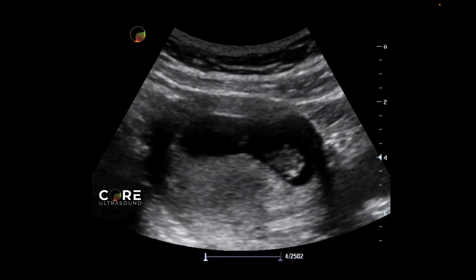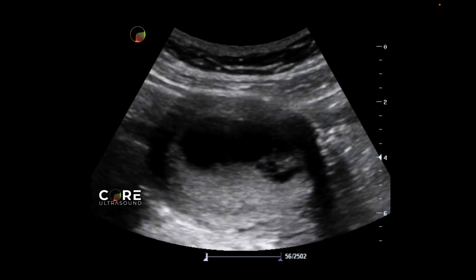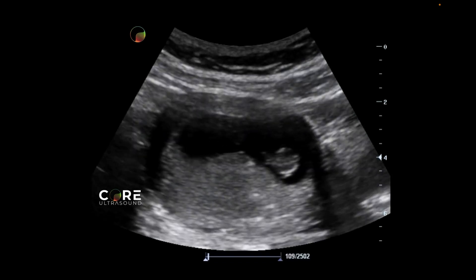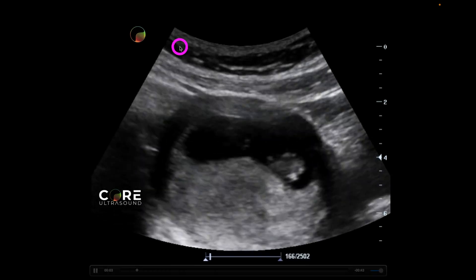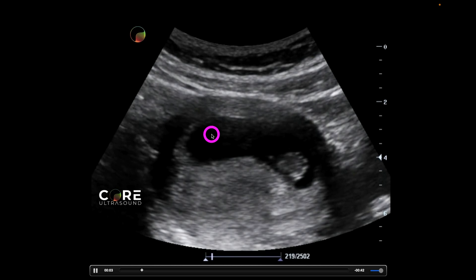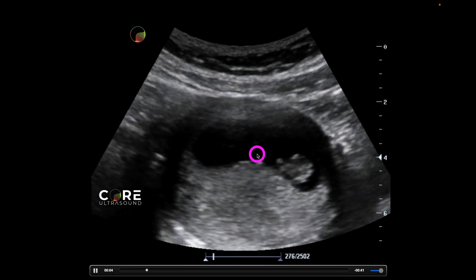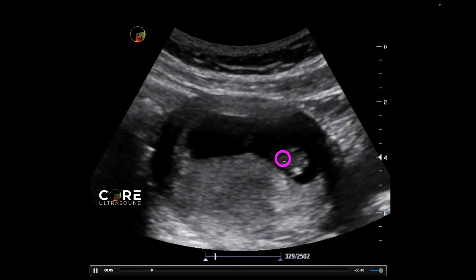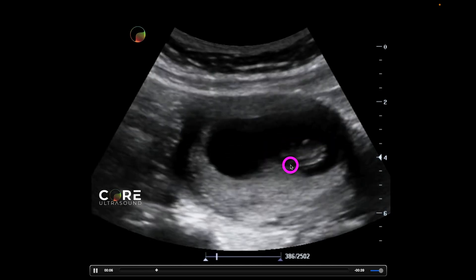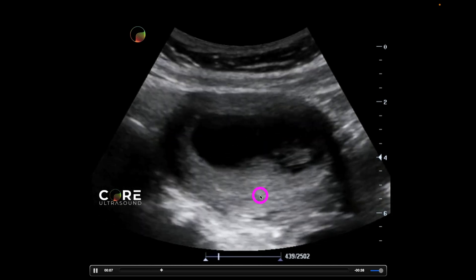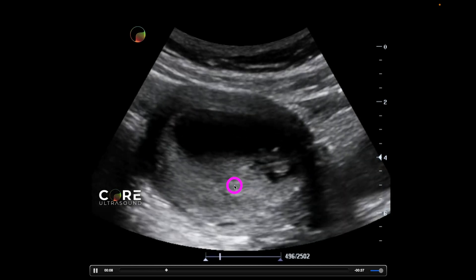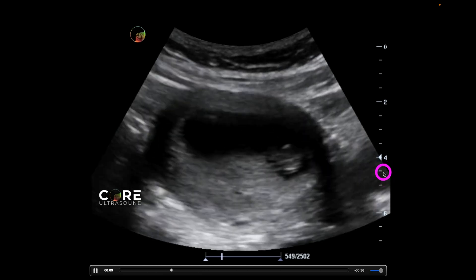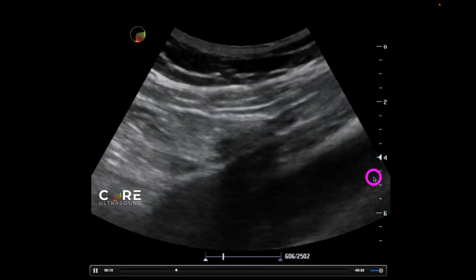So the first step here is to identify that pregnancy, preferably an intrauterine pregnancy. Here's an example of an intrauterine pregnancy. We have the gestational sac, we have the fetal pole over here, this is placenta, and we have some bladder over here.